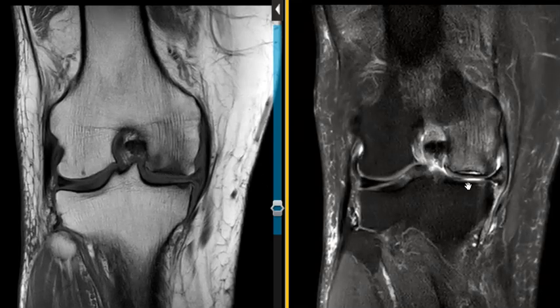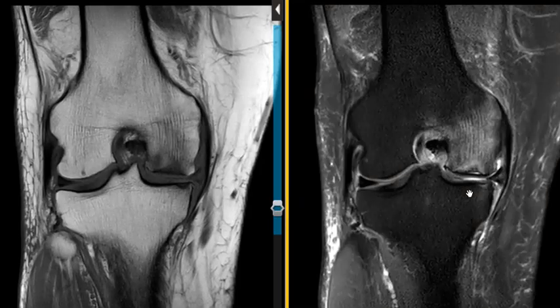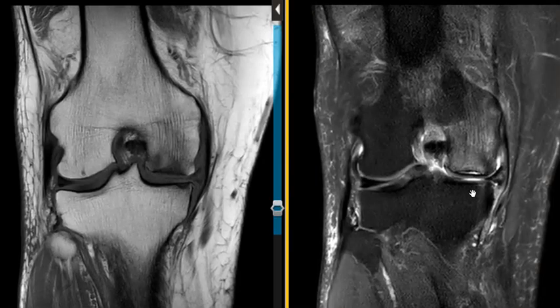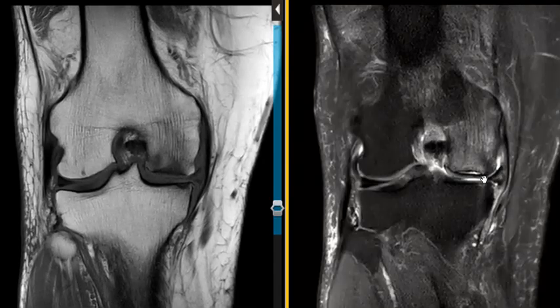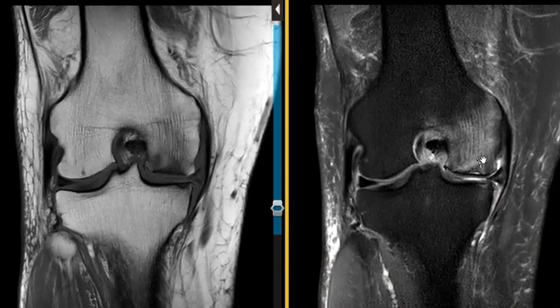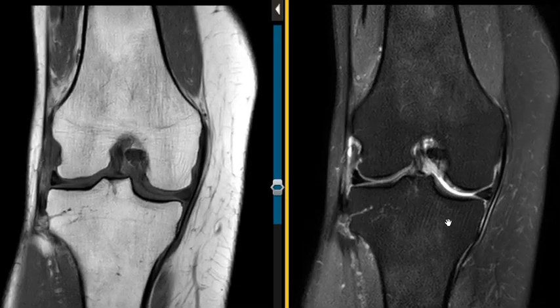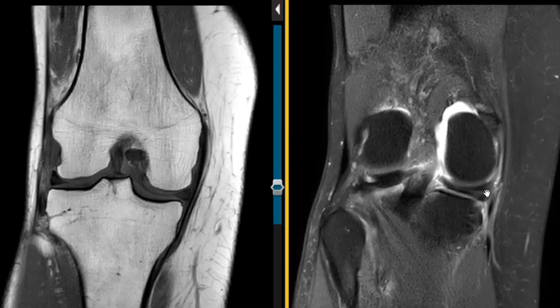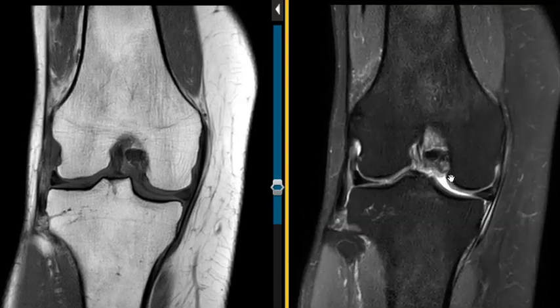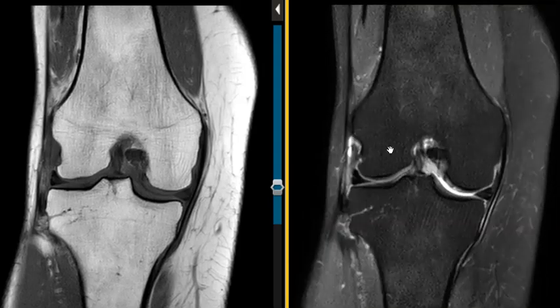It's starting to flatten and collapse, and eventually this will collapse further, and there will be a need for a knee replacement. This is already pretty extreme at this point. This is a finding related to a torn meniscus root — we get pseudo-extrusion, then stress reaction, and eventually a stress fracture. With the other patient, we caught them in time. They can go and reattach this meniscus root — it's a fairly difficult surgery, but they can reattach it and prevent them from getting a stress fracture. Thank you very much.